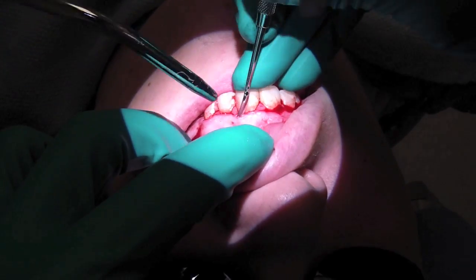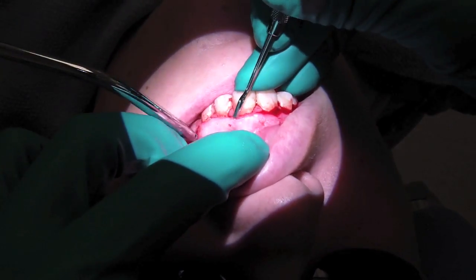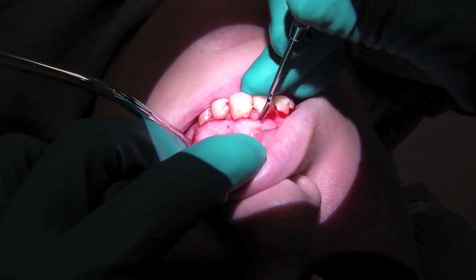Here I'm delicately starting to elevate the flap with a Woodson. I'm doing this under the microscope.